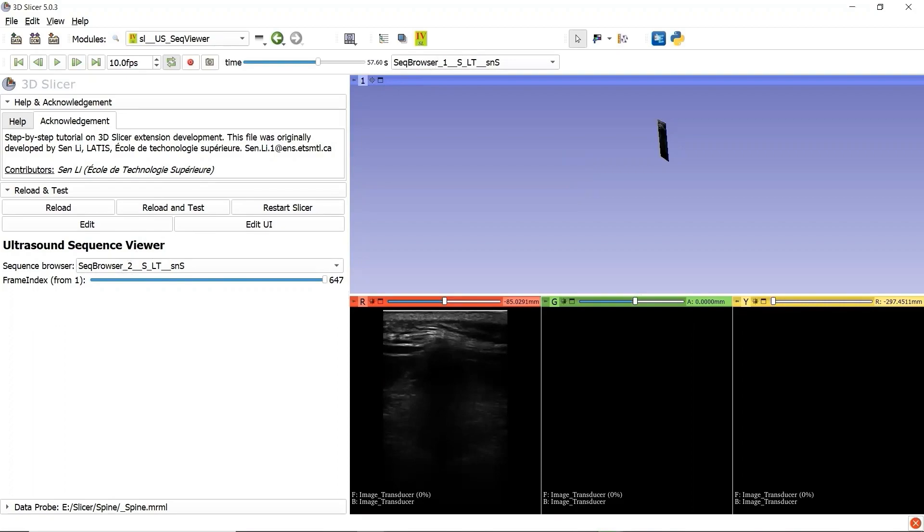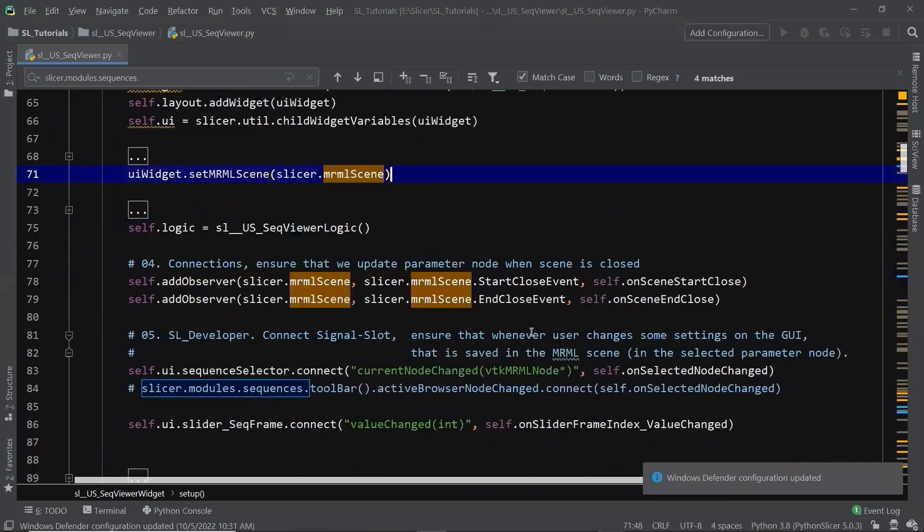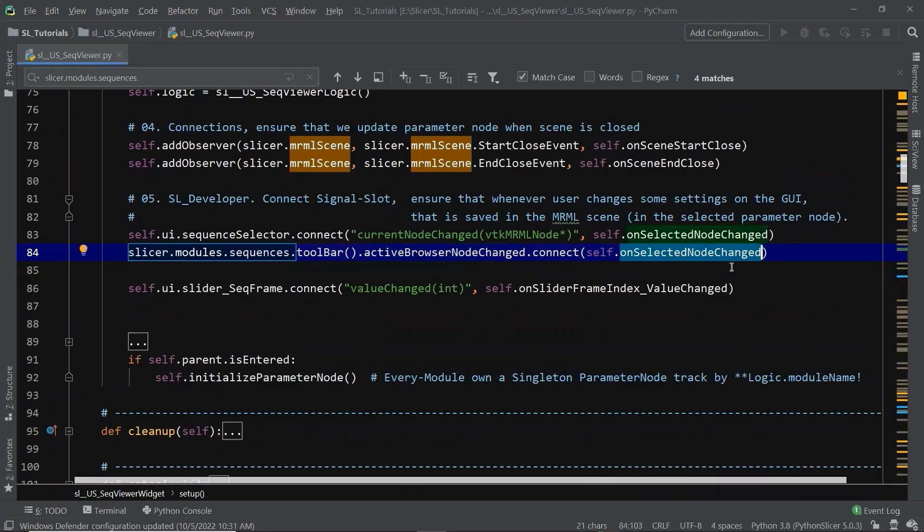Let's go back to PyCharm. We are in the widget class function setup. Let's go to step 5, where we can connect the signal of slicer modules sequences toolbar active browser node changed to our slot function on selected node changed, so that when the Sequence Viewer given by 3D slicer changes, our module will update.